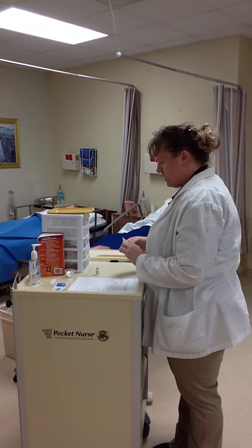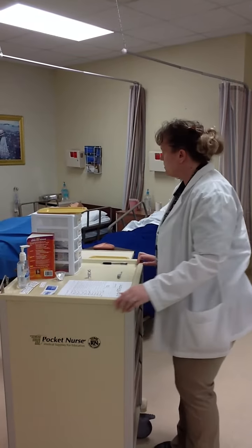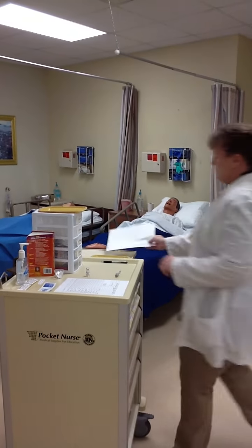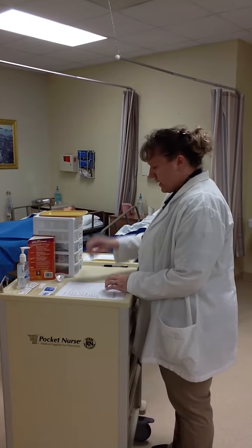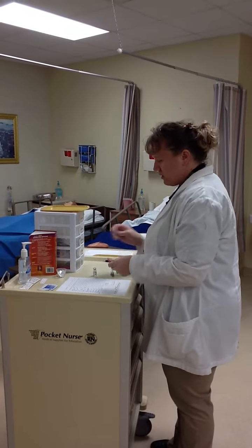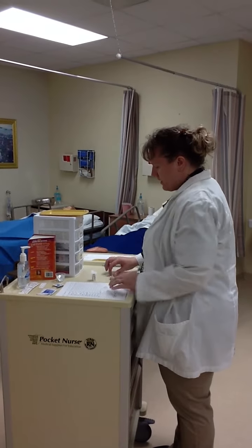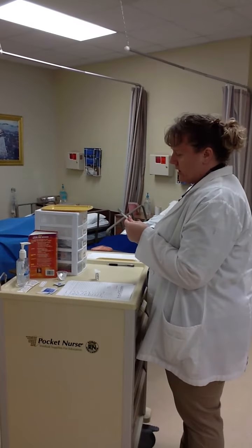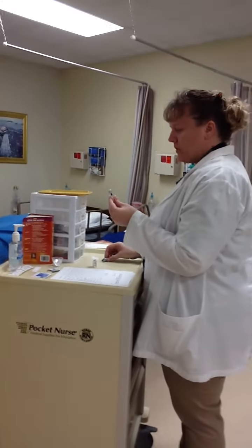I'm going to open my syringe. I'm going to grab some labels. I have my tuberculin syringe. I have my PPD vial. Since it is a multi-use vial and someone has already opened it, I'm going to use the alcohol and make sure that I clean the top off. Once I clean that off, I'm just going to let it sit there until I have my syringe ready. I'm going to draw that back to 0.1, which is my dosage.